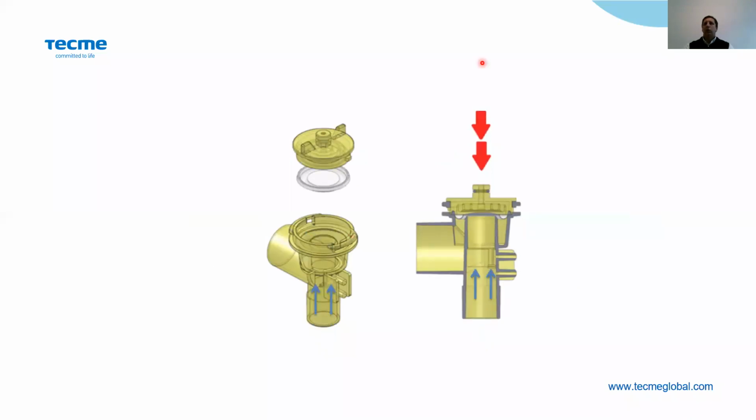The machine is going to make pressure over the diaphragm in order to close the system during the inspiration, and is going to open the diaphragm during the exhalation, so the patient will be able to exhale through this expiratory set. In this exhalation, the machine is going to measure here the flow exhaled by the patient and is going to calculate the volume.